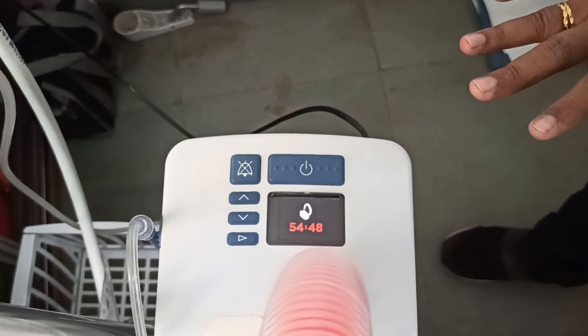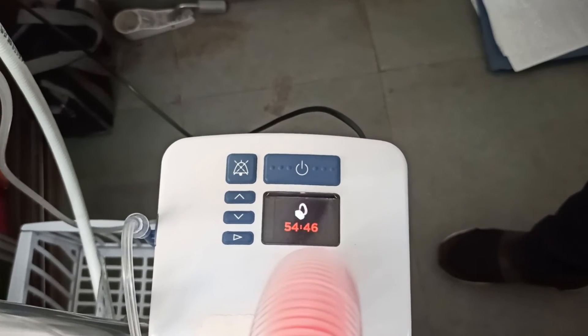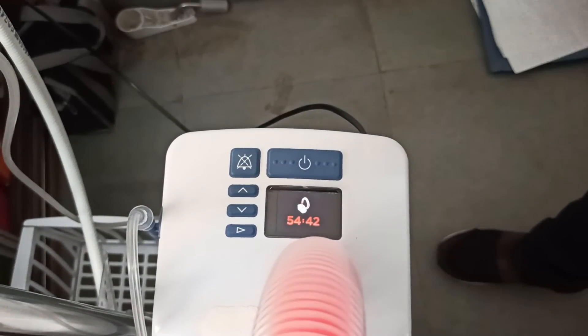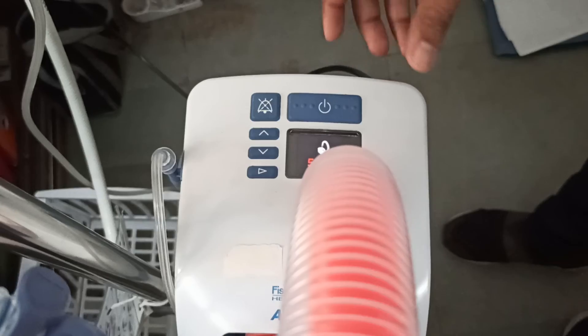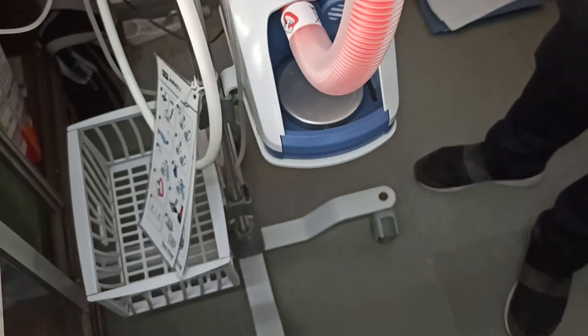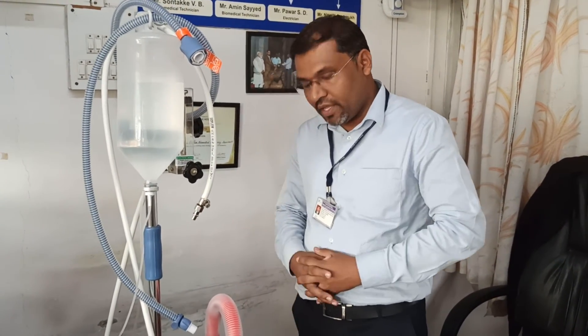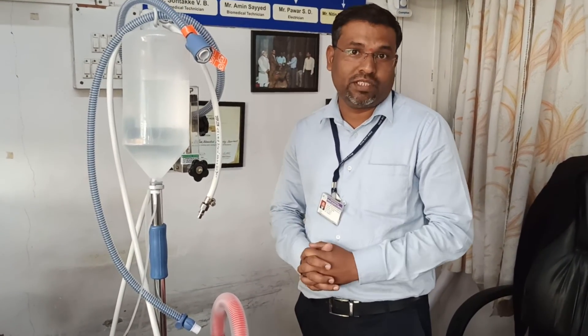Once the disinfection is completed, the machine will restart and you have to connect the humidifier and remaining accessories, and then you can use the machine for another patient. So this is the basic process regarding the disinfection of your AirVO2 HFNC machine. Thank you.